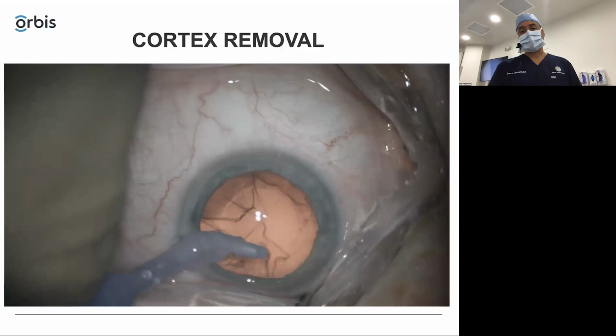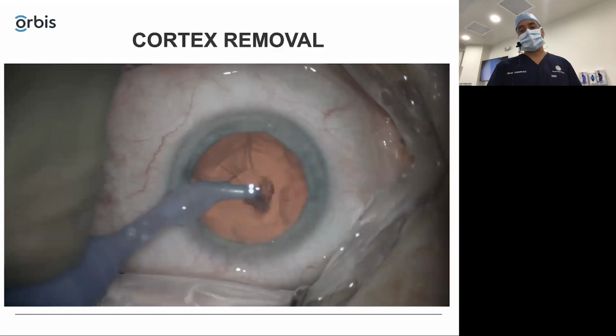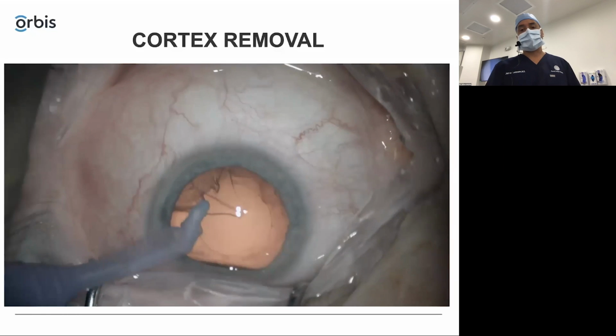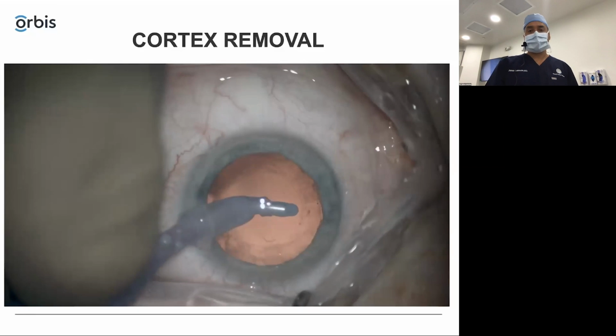I think the last time I broke a capsule, it was during this step, which by then you're thinking, man, I'm already out in the clear and it's all easy now. But anyway, you can see here, this is pretty straightforward. This is not the hardest part of phaco to master. Really the hardest part is doing good quadrant removal and good rotation of the nuclei.